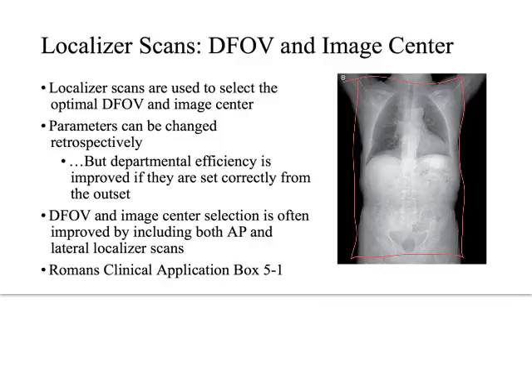Okay? The other thing that's happened with this is I've determined now an image center, right? And so there's some imaginary line through here that's the center of the image, right? And you can see it's slightly to one side of midline for the patient. So I can make an image center that's a little bit different from isocenter. I can set up these images to be centered however I want. So there's some latitude there, some freedom to draw this box on there however I want.